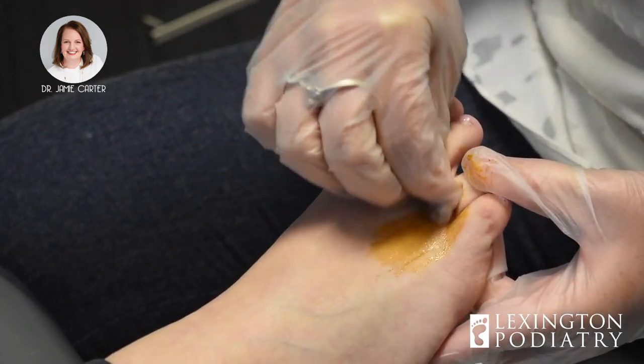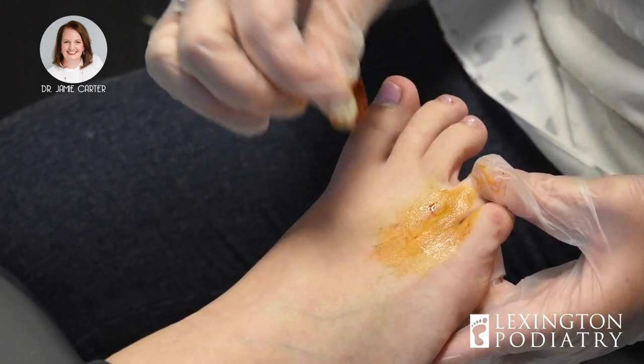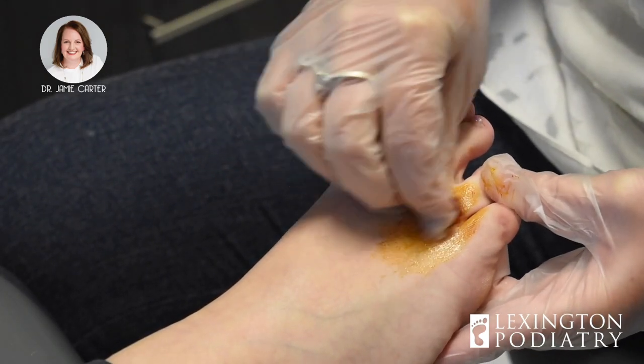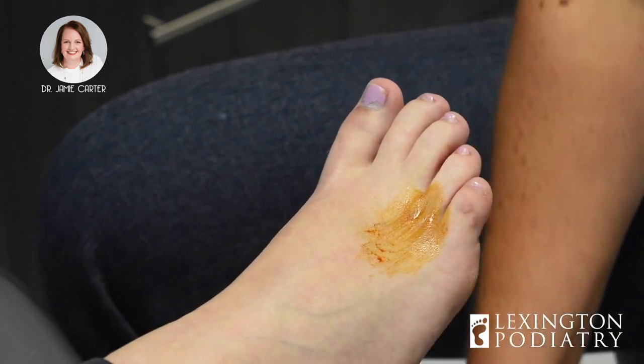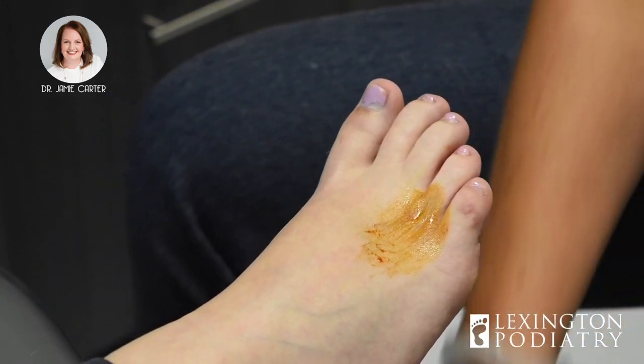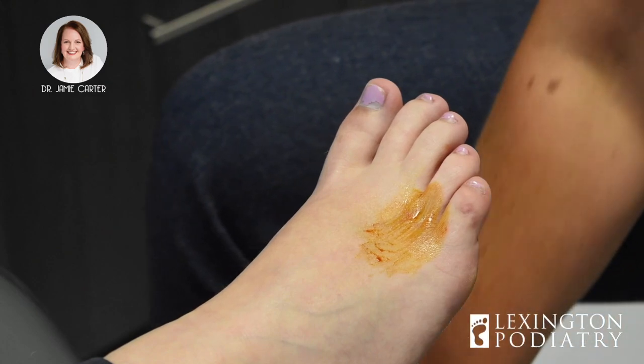Anytime I go into a joint, I use iodine to cover the area because it's more antiseptic than alcohol on its own. I usually mark the space — I'll push around to see where it's tender, and that's what I mark.